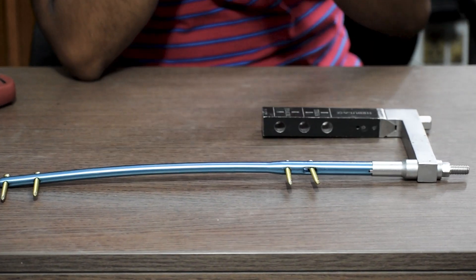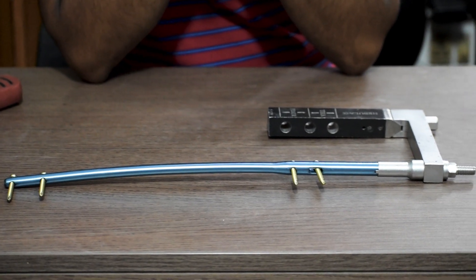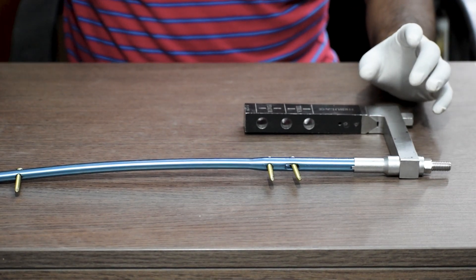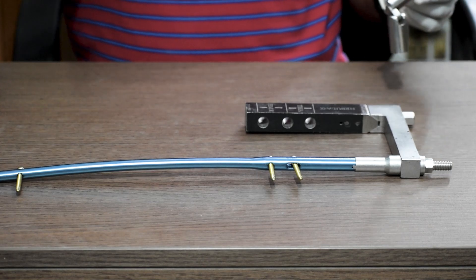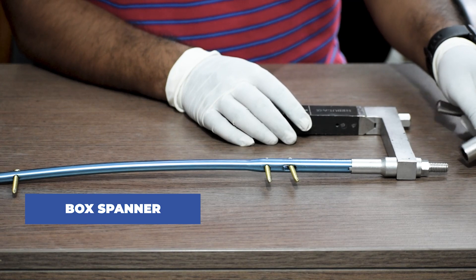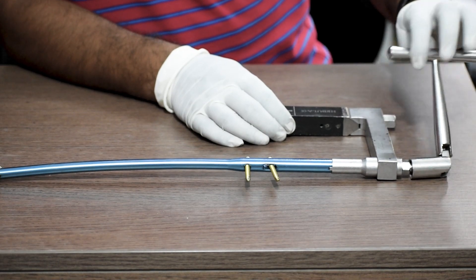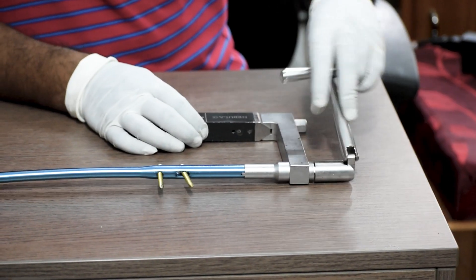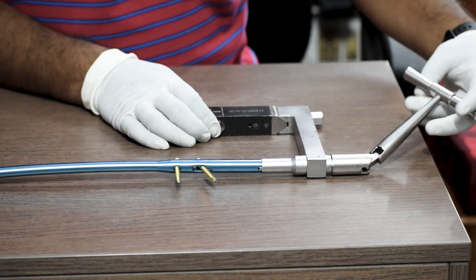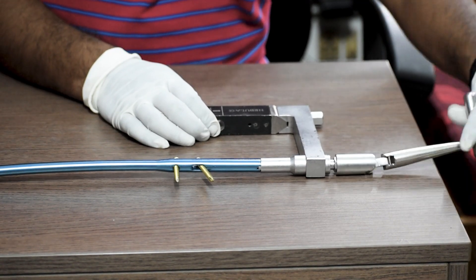This is how it will look. After this entire process, we will remove the jig from the nail. To do that, we use a box spanner, because when the nail is inside it is hard to hold a regular spanner. With a box spanner you can operate from any angle — straight or any other angle — and then apply a little bit of force to open the conical bolt.